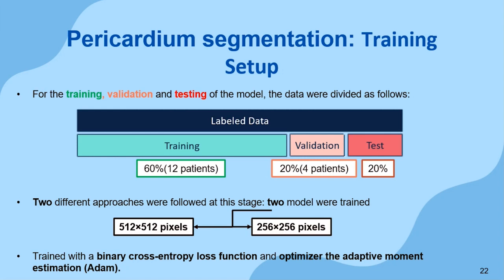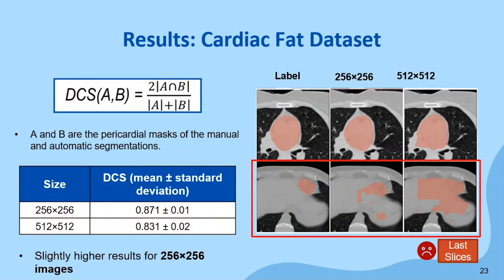To evaluate the performance, the Dice was used, which evaluates the degree of overlap of 2 images through their pixels. The value of Dice ranges from 0, indicating no spatial overlap between the 2 segmentations, to 1, indicating complete overlap, and of course we want as close to 1 as possible.